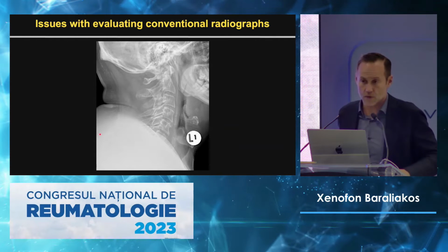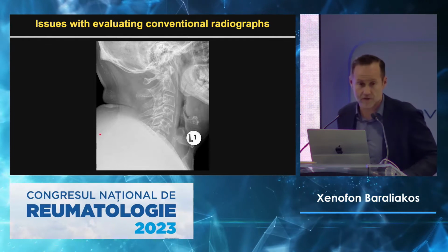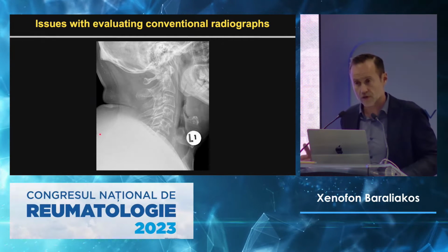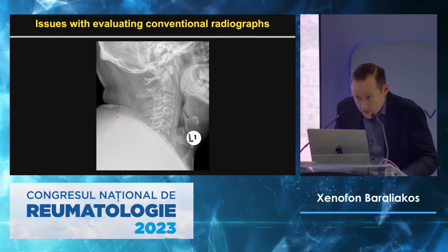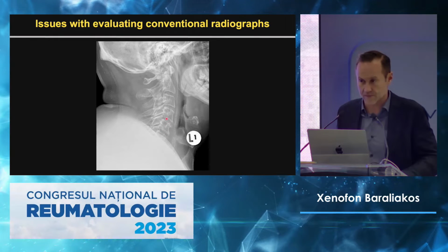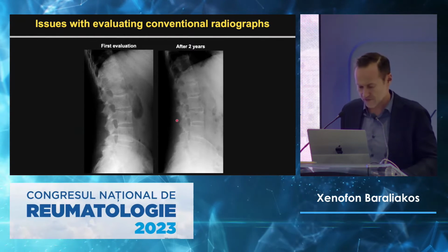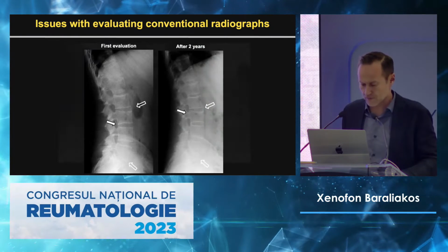Now, we also spoke about pitfalls, and this presentation is about pitfalls, and sometimes you have the pitfall that the patient causes the problem in terms of his or her posture, especially in those who are like this or do have back or neck pain. You may not even be able to see the entire cervical spine. Yeah? Or in obese patients, you may not be able to see everything.